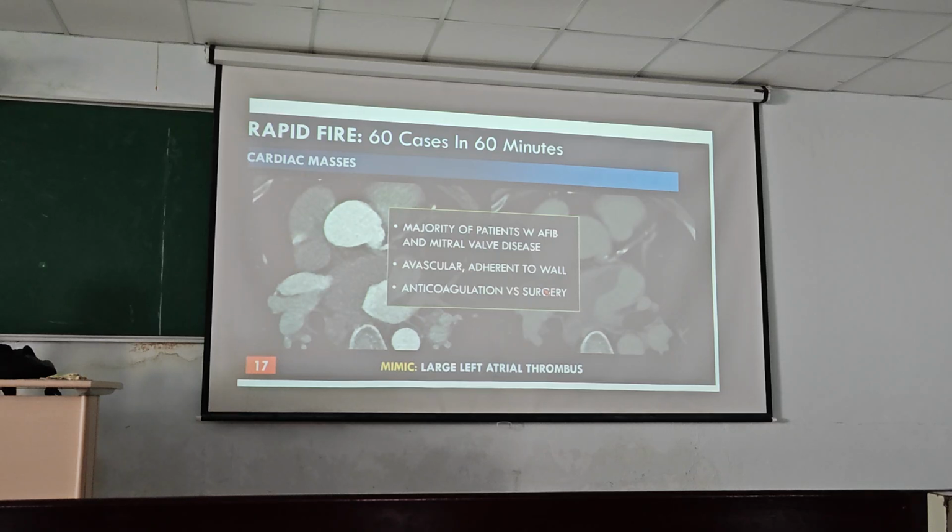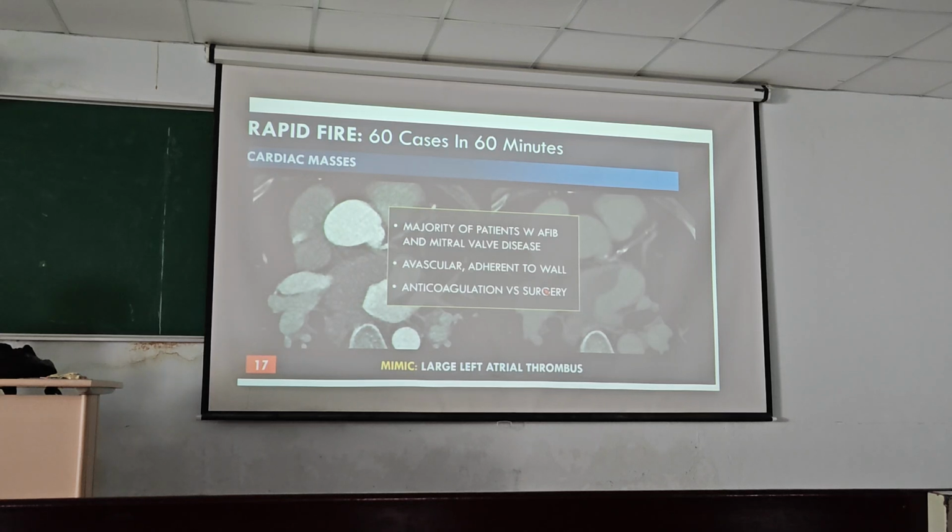Yeah. So we have a whole bunch of cardiac MRIs for that indication. The cardiologists do echo, and then they can't tell, and they send it to us. By the time we do the cardiac MRI, which is maybe a week or a couple of weeks later, it's gone because they put the patient on anticoagulation.